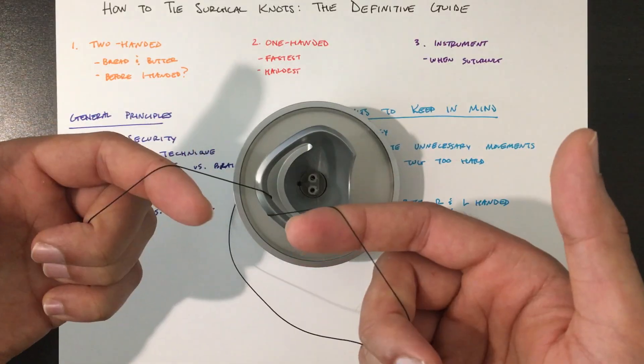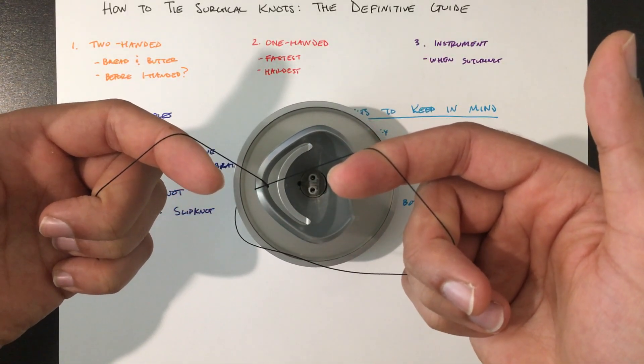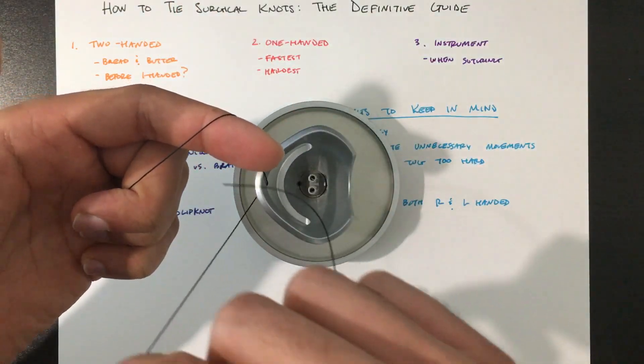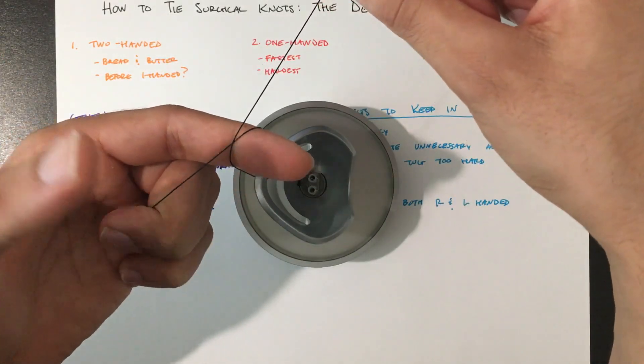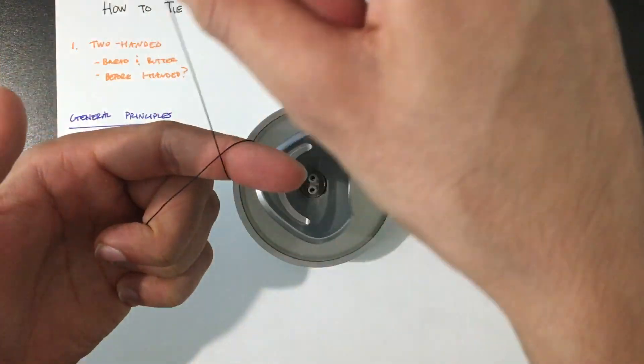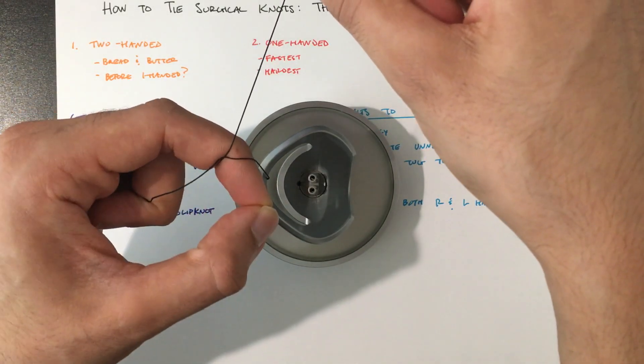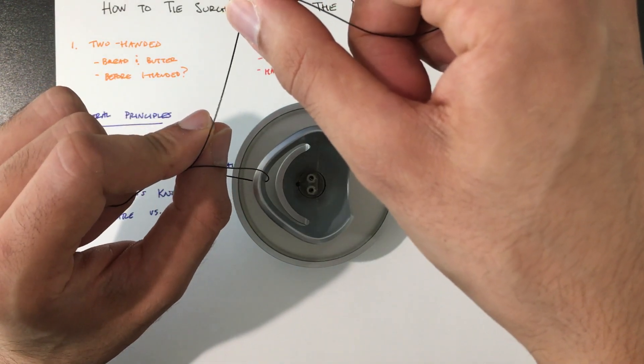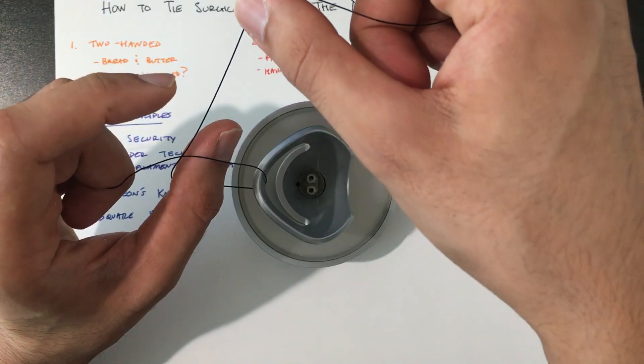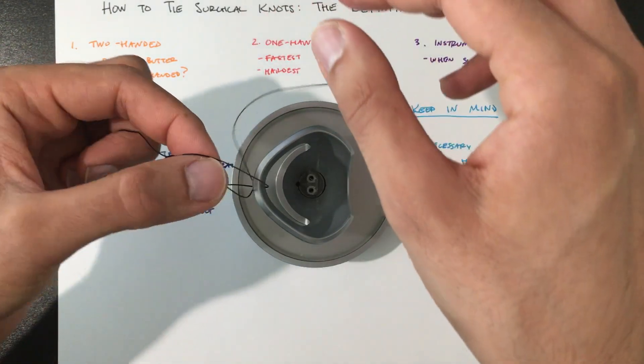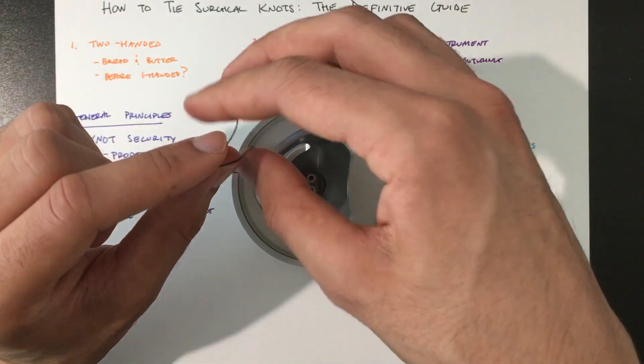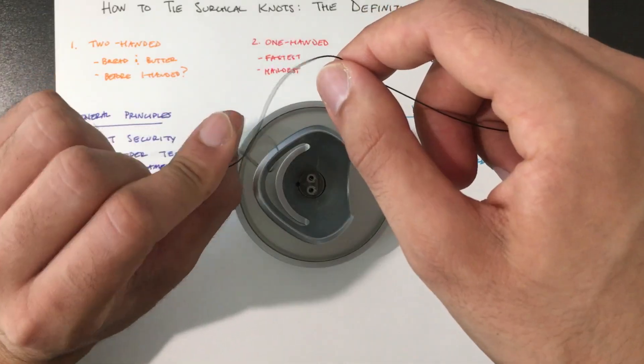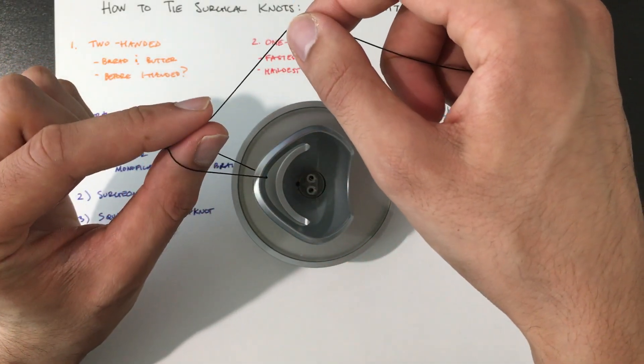So I'll show you first with your left hand. Start off by grabbing the suture like so. Pass the suture to your other finger in the opposite direction. Close with your thumb. So again, opposite direction, close with your thumb. Now you have this ring that can move back and forth. So I want you to move to the other side of the ring. Then with this end, pass it between, pinch, and bring it back. So again, we're like this, ring, pass it through, pinch, bring it back.